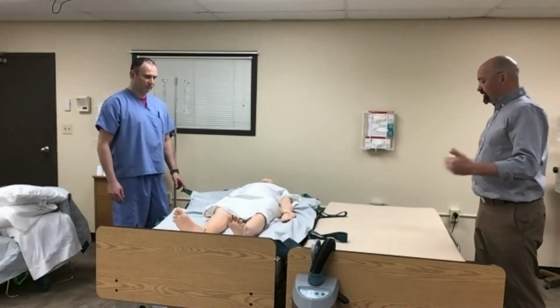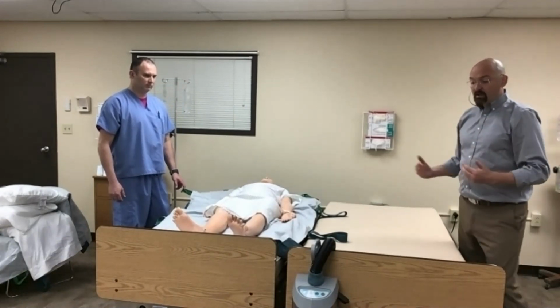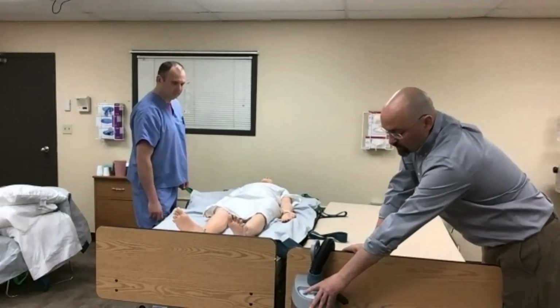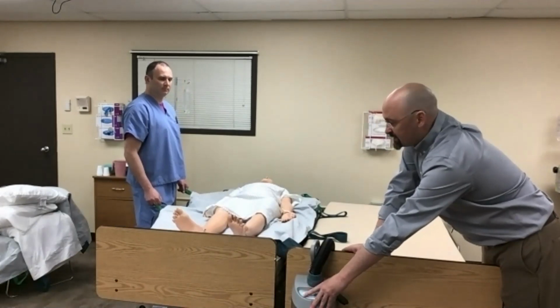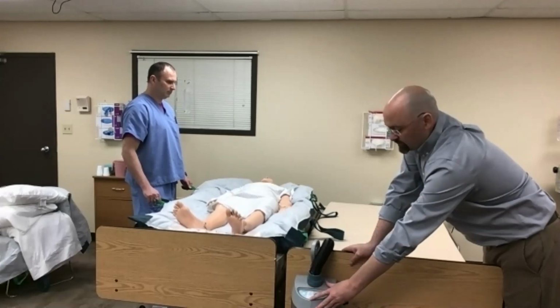If we were to go straight across and you have too much height, that is actually the proning technique we're going to use. So first, he's going to grab a hold of the mat and say, Chris, turn it on. Now we're going to use the adjustable button on the air canister to make sure our patient is centered on the HoverMatt itself. We can slowly inflate it. He's centered.